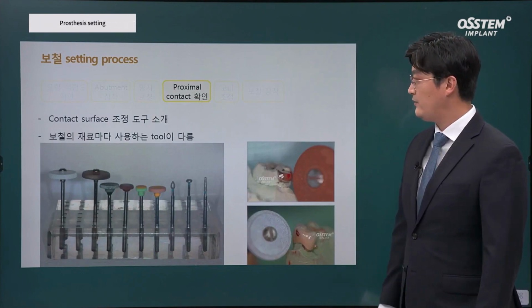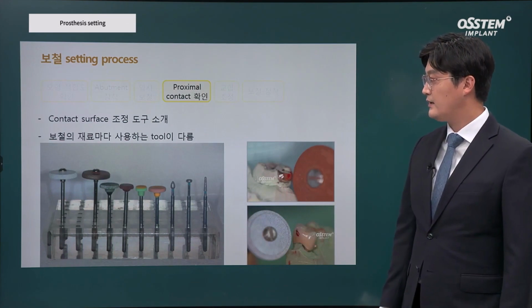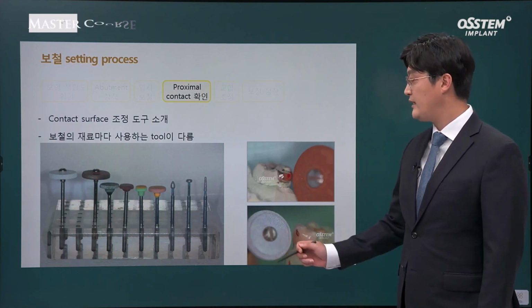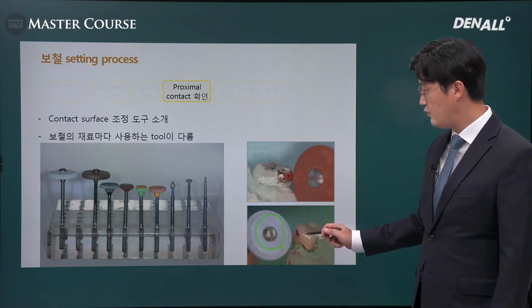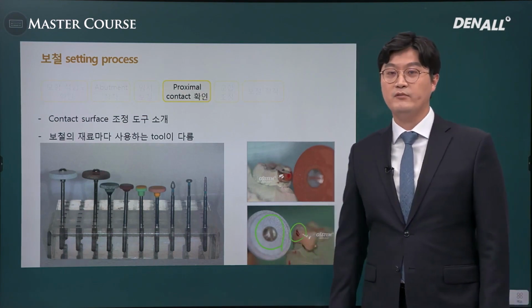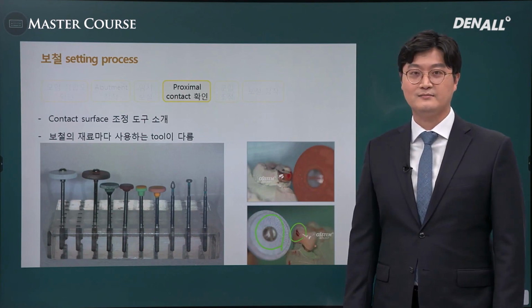There are many tools that can be used for adjusting proximal contact. There are different materials preferred by different dentists, and depending on how much strength is applied and what kind of rotation is provided, proximal contact amount changes, and therefore personal experience and know-how is important.